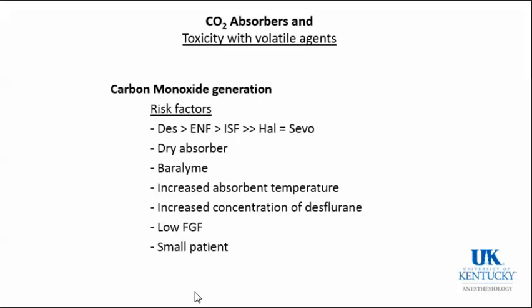The other notable toxicity was the production of carbon monoxide. This is most prominent with Desflurane and very little with isoflurane and virtually none with sevoflurane. Again, Baralime was a bad agent, and it was due to drying of the absorbent, and it was called Monday morning syndrome.